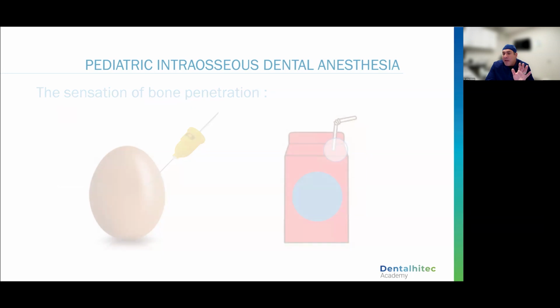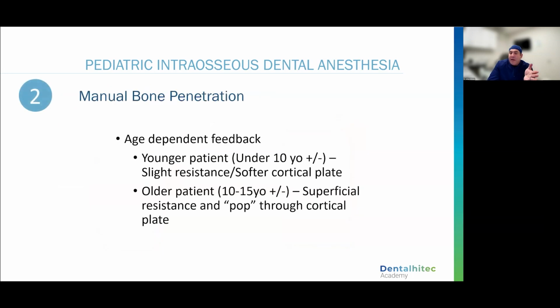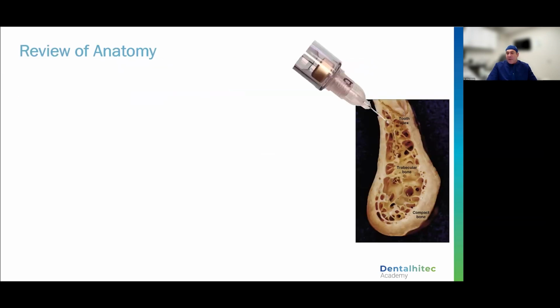And just remember, you may not always feel that penetration. And these are not set in stone, this is just my feedback, is that under 10, you're going to feel kind of resistance. You won't always feel a pop. 10 and above, you're always going to feel a pop. I find 7, 8, it just really depends on the size of the patient, how thick that bone is.